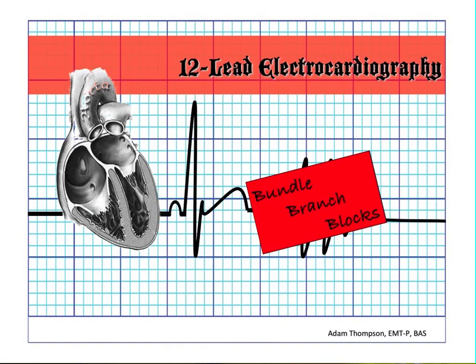I have a new lesson here on bundle branch blocks. If you'd like to stick around, it's going to be a two-part, really quick series. Just to give you some information, not only how to identify a bundle branch block on a 12 lead EKG, but what a bundle branch block really is. So stick with me, and we'll get through this. It's going to be really, really quick.